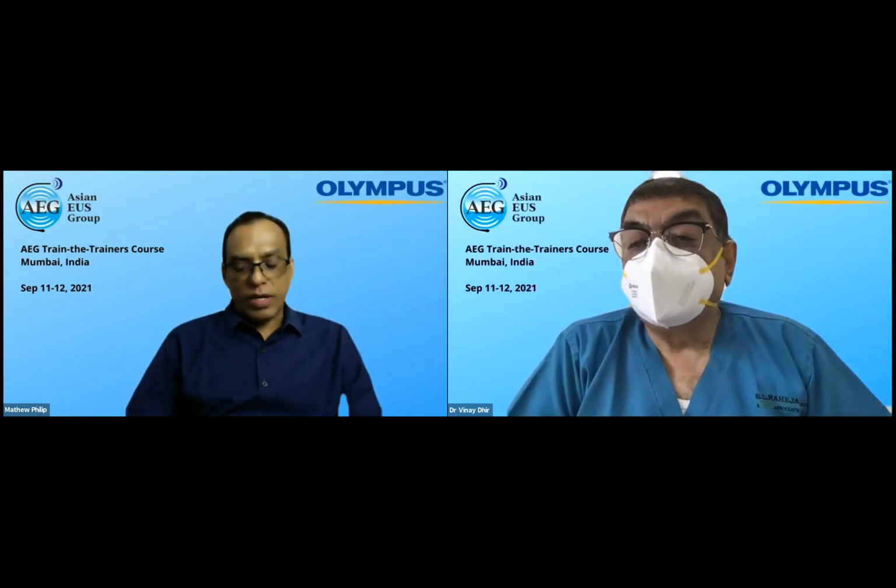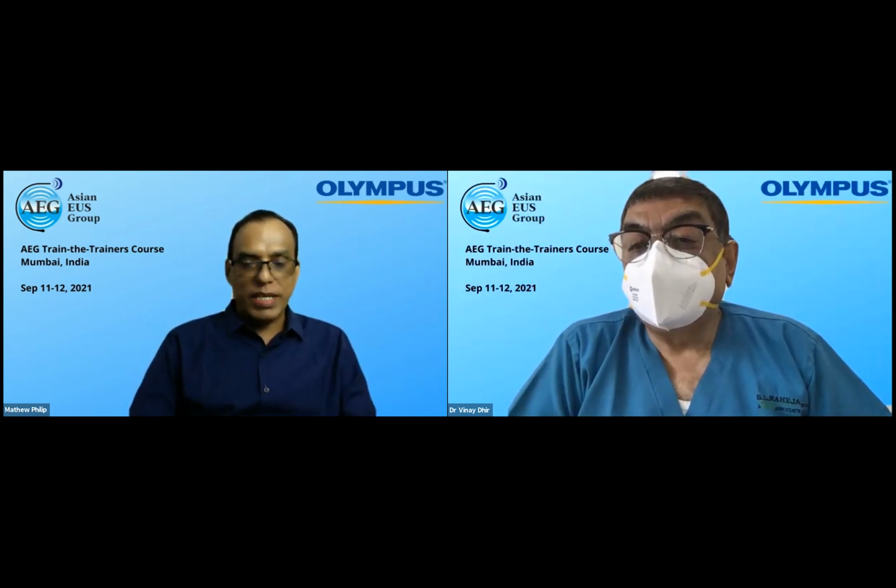See, for me, once you put the stent, we never look at that, because you send the patient away to home, and only if they are symptomatic, then you need to look at that. And if there is a problem there, I think you have to manage it. I have never seen that, but you treat it with the PPI. They usually improve. They should improve. Otherwise, there is no major necrosis. They should improve.